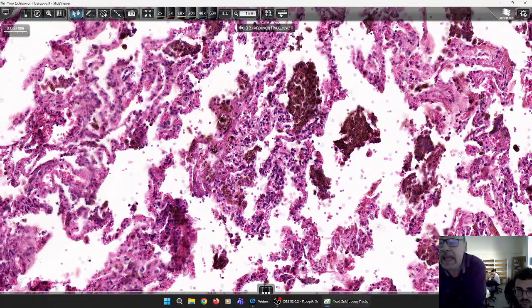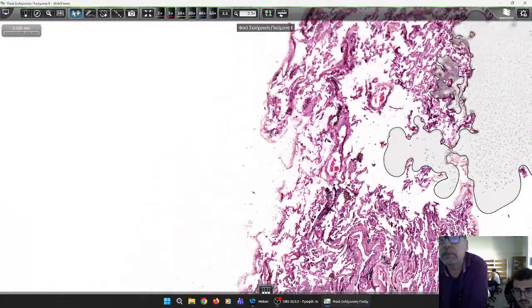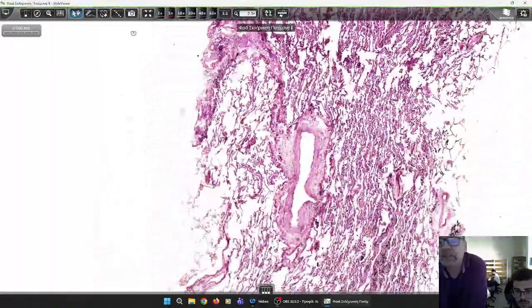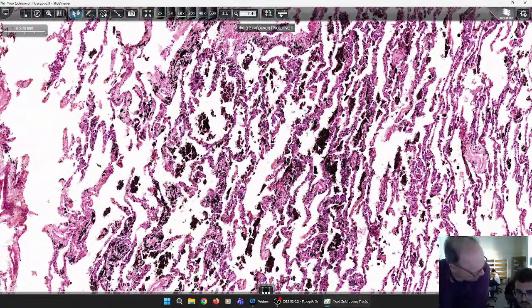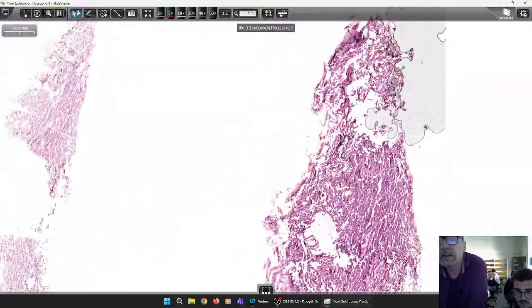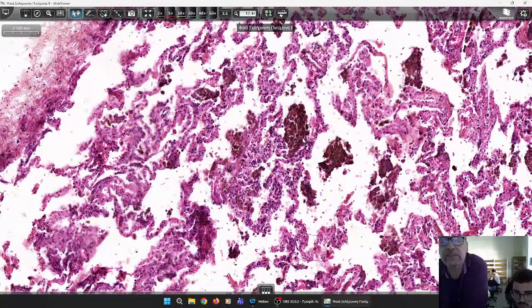So in these areas we have hemosiderin deposition due to congestion in the pulmonary circulation, this is carbon. You see? It's different. It's black, Theophanis. Whereas the other one we saw was brown appearing. However, Perls will discriminate the two.